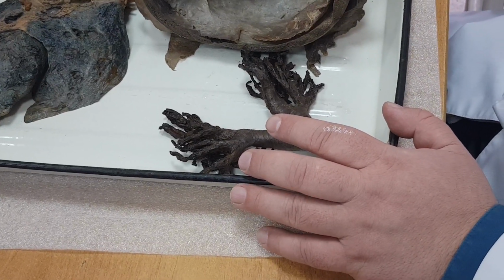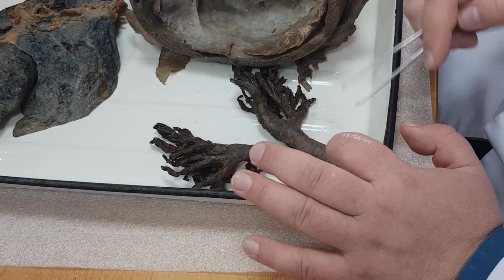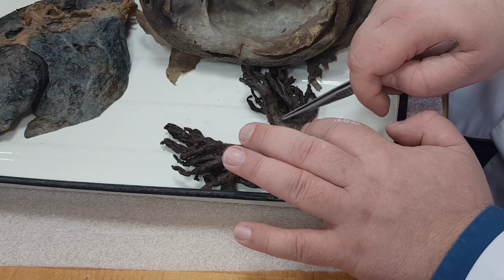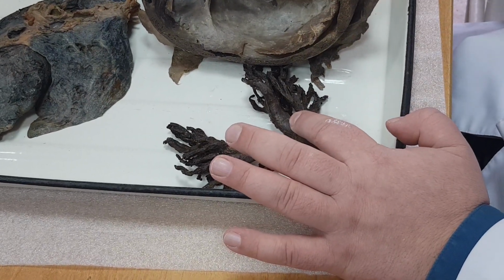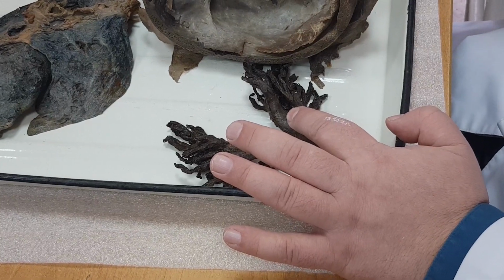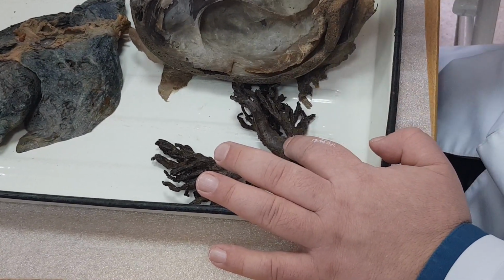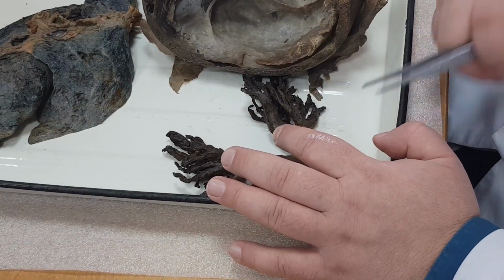In this case, you need to insert a bronchoscope into the larynx, then into the trachea, then into the right main bronchus, then continue into the inferior segmentary bronchi, and try to find where this object is in the inferior lobar bronchi and remove it from the bronchi, because it is dangerous for life.